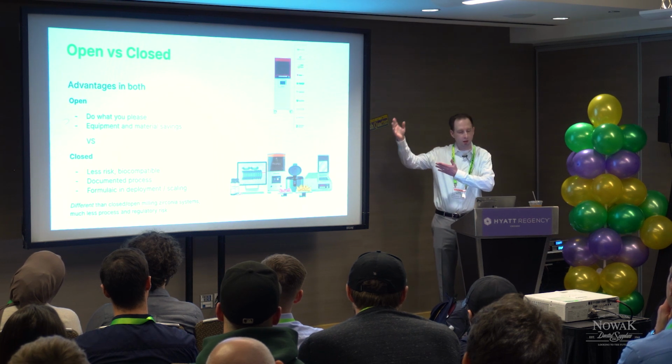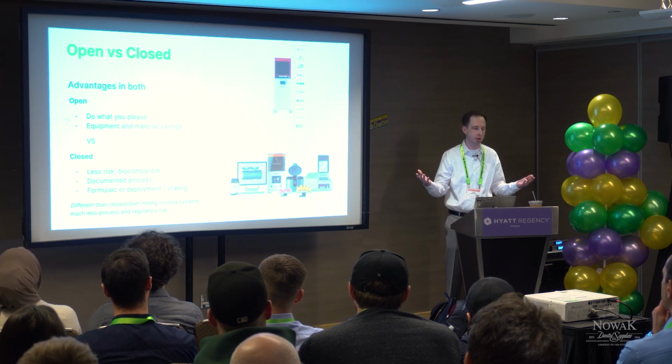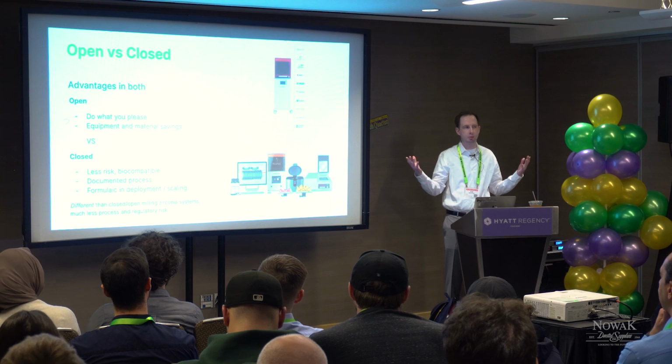The advantage with open systems is you can do what you please. You can put more material in it, you probably get the printer for less and get material for less. So there's savings to be had there, right? But just keep in mind that there's not going to be that support or that process for you to build on top of. This is kind of like what I was saying about zirconia. If you've got the resources or the engineering talent or the team to be able to take an open system and make it work, because a lot of times with open systems and open materials, if you read the instructions for use, it has general guidance, whereas a more specific closed system is very specific. And those general IFUs leave a bit to be interpreted, and there's risk around that. So is that something you want to go down?